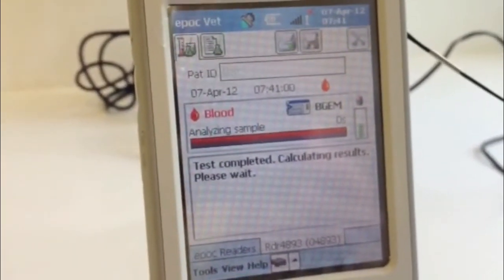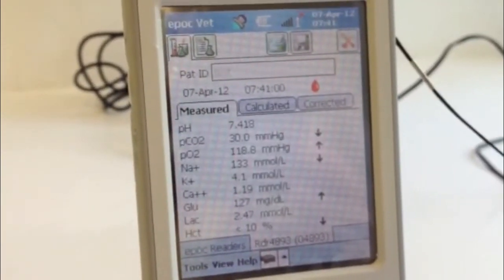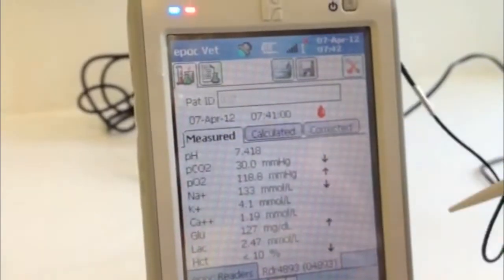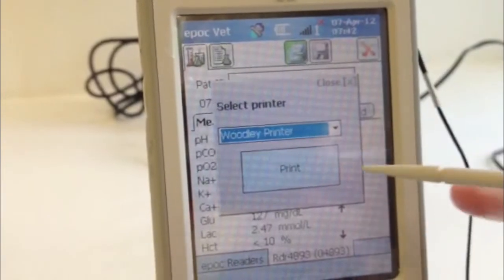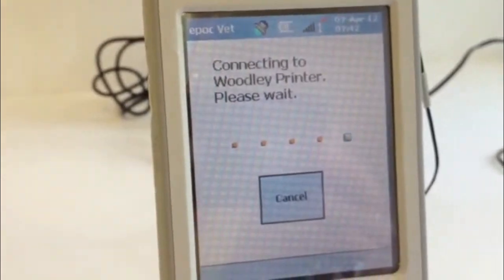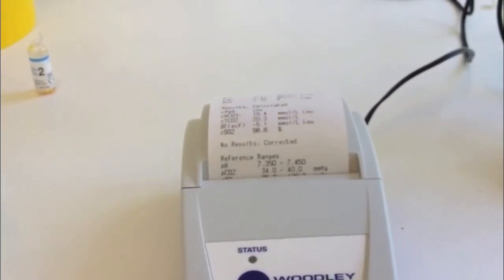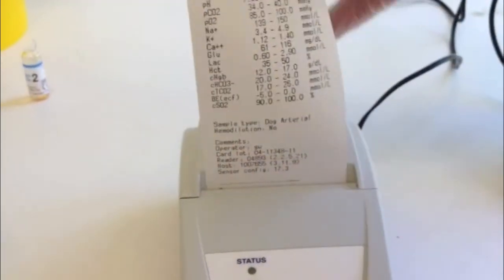After 35 seconds, the results will be displayed. Click on each of the tabs to display different results. Press the print icon to print your results on the Bluetooth printer if present. The printout will show your measured and calculated parameters, as well as the reference ranges for your chosen species, along with patient, operator, and test card information.